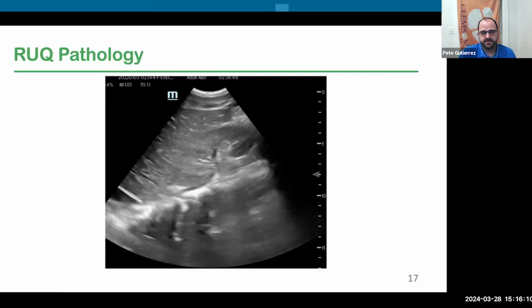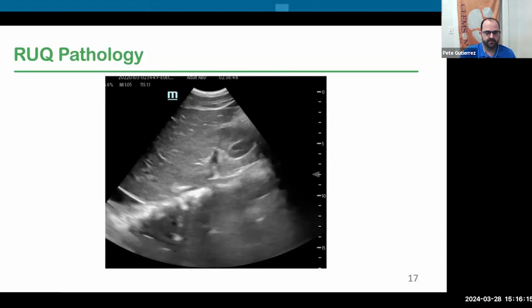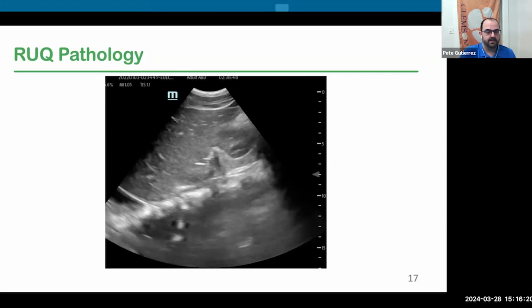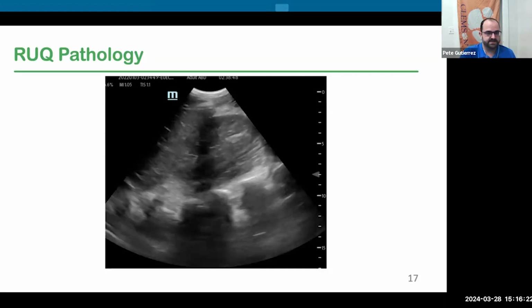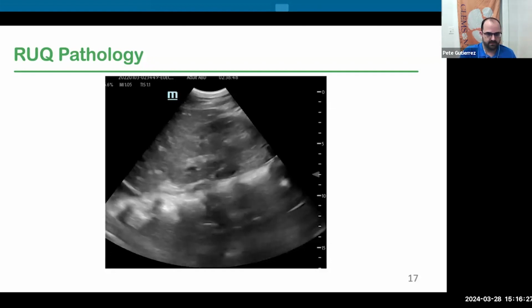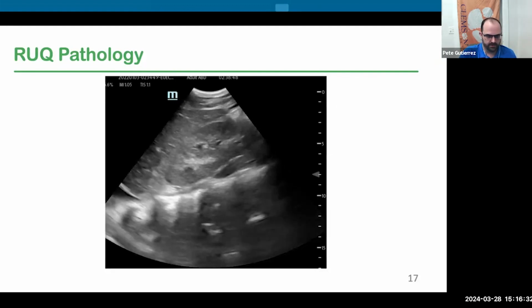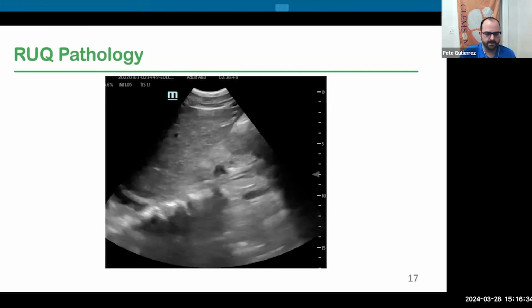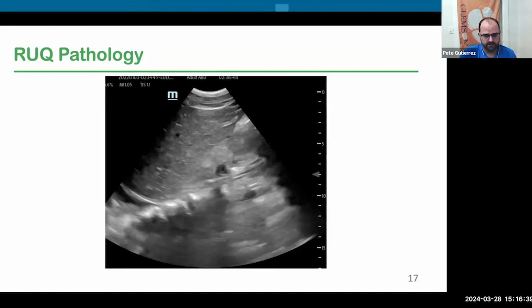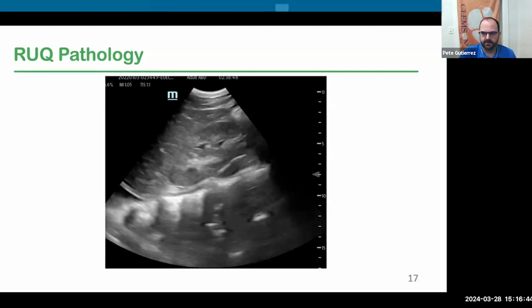There are other conditions other than trauma in which you can see a positive spine sign. So for instance, if you had a kiddo with nephrotic syndrome who had anasarca and they had a pleural effusion, it would look the same. If there was a child who was having cough, difficulty breathing, fever with consolidation on chest X-ray, a parapneumonic effusion would look the same. Because we have to put our radiology hats on and clinically correlate to what we're seeing in front of us.